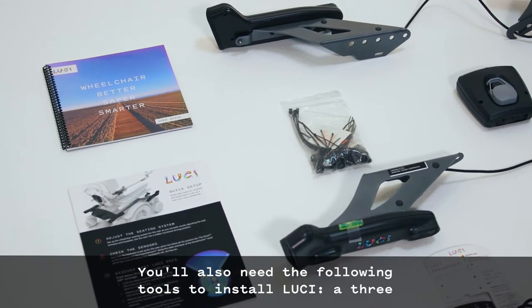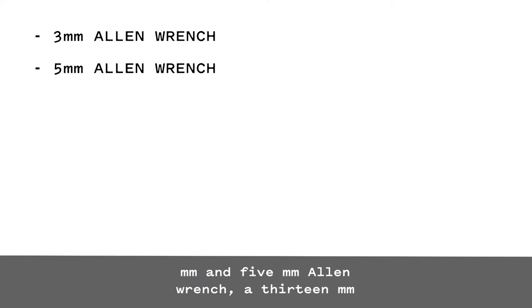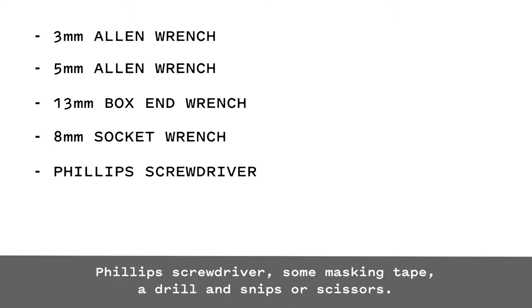You'll also need the following tools to install Lucy: a 3mm and 5mm Allen wrench, a 13mm box end wrench, an 8mm socket wrench, a Phillips screwdriver, some masking tape, a drill, and snips or scissors.